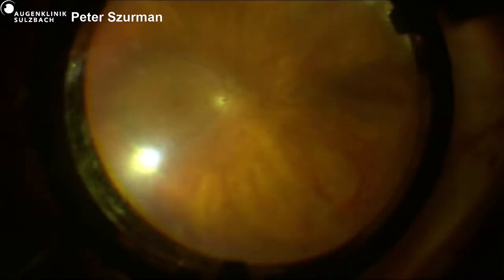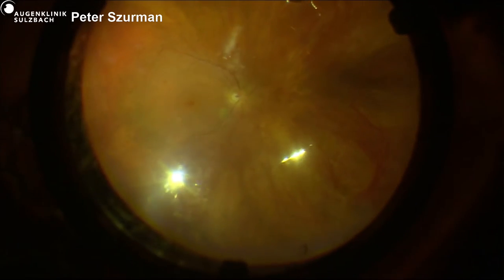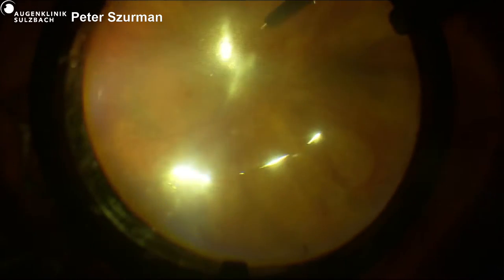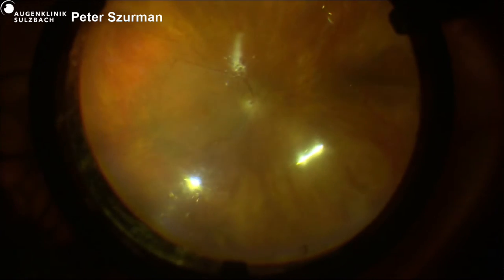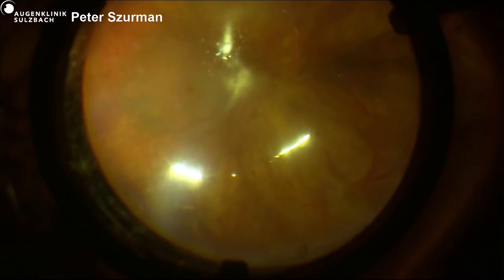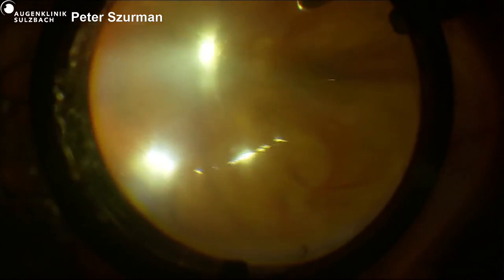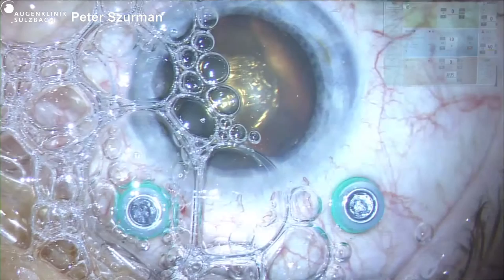So, Peter, I just saw you bubbling something into the eye. Yeah, I've bubbled something in the eye. Basically, I show you. I've removed the ILM remnants, and in fact, there were more ILM remnants than was visible in the preoperative OCT. So this might be the reason, but still the persistent macular hole is quite large, and I don't think that a resurgery without any additional patch will solve the situation, and therefore we will implant an epimacular amniotic patch. That's what we will do.